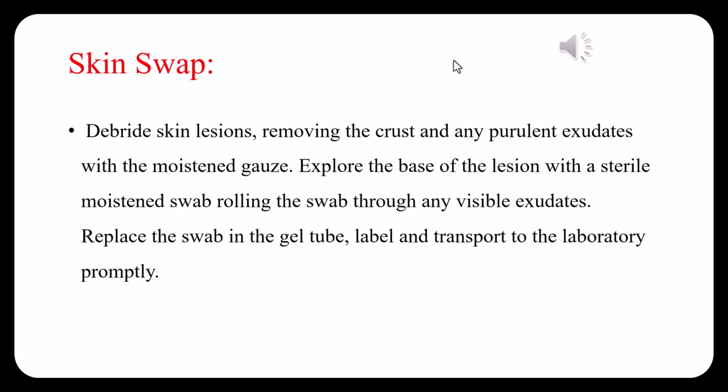know, a tube for the collection of blood. We're here talking about the transport media, the transport media which contains a gel. That means a transport media. We put this swab in it, and then we transport it to the laboratory.